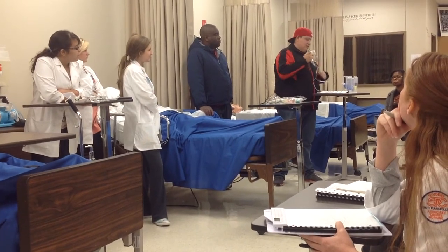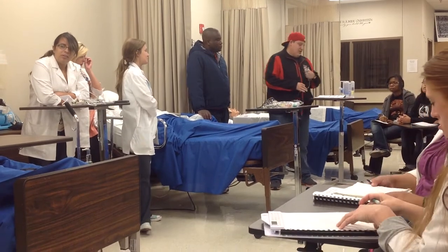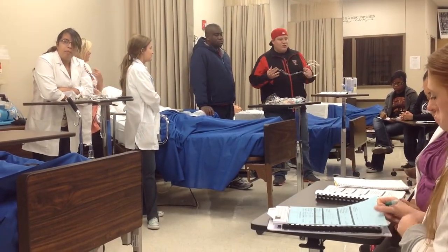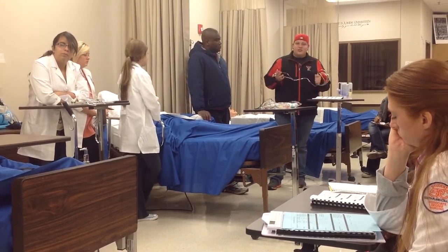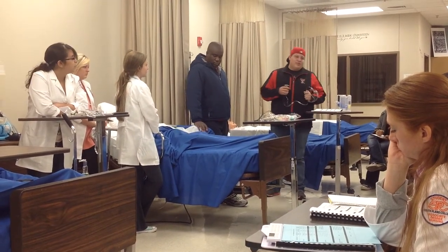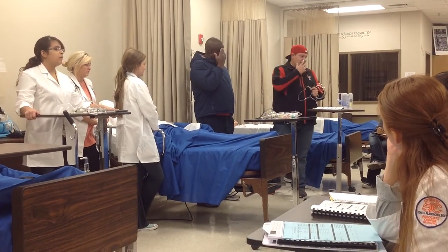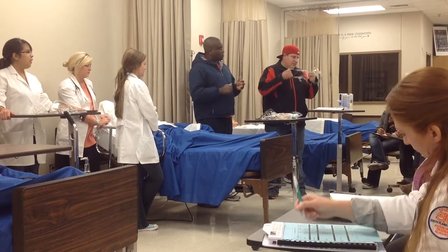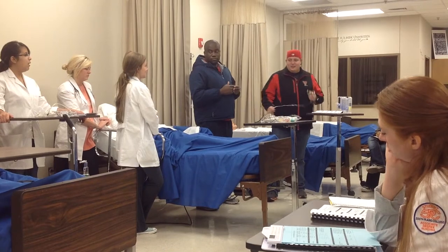So this, you can see on a little chart, you can look on page 44 of your little skills book. It can give from 1 to 2 liters with oxygen percent of 24 to 28%, 2 to 4, or 3 to 4 liters, 32 to 36%, and of course 5 to 6, 40 to 44%. But after 4, you don't want to really use this because it really dries out all the mucosa in there. But the good thing about this is it's real easy. You don't have to take it off to eat. And that's about it on this.